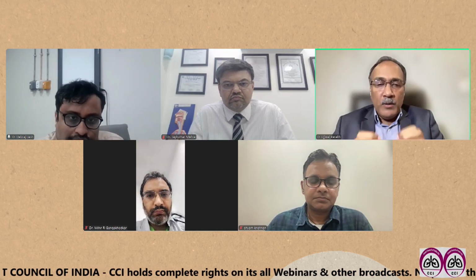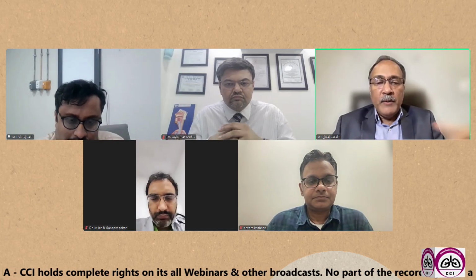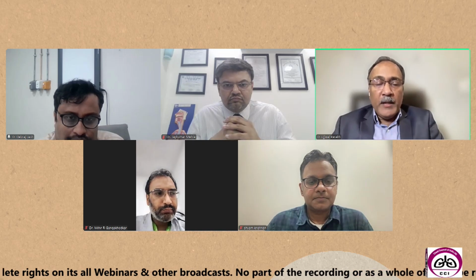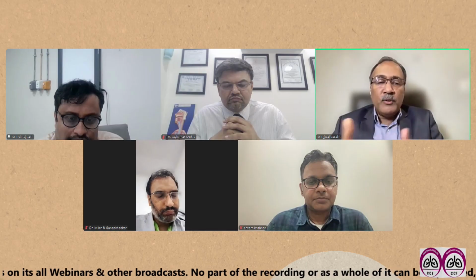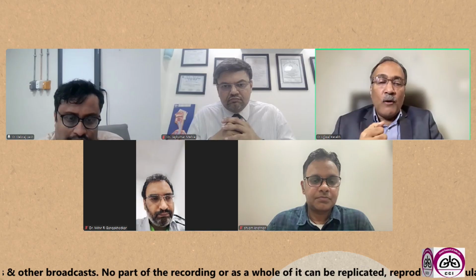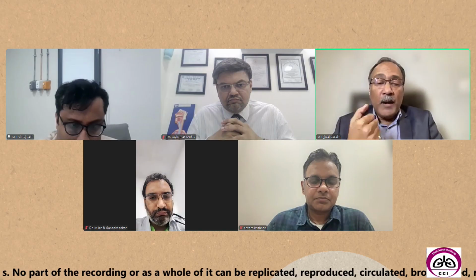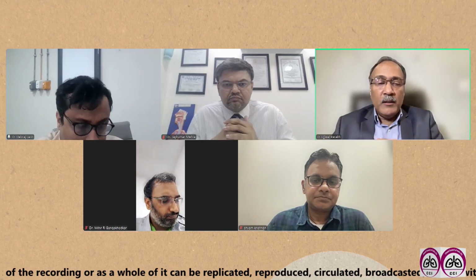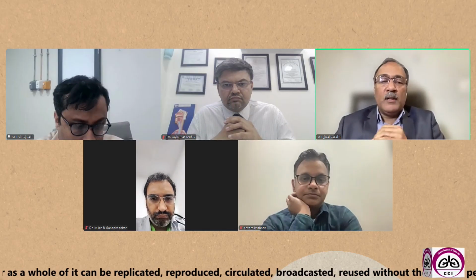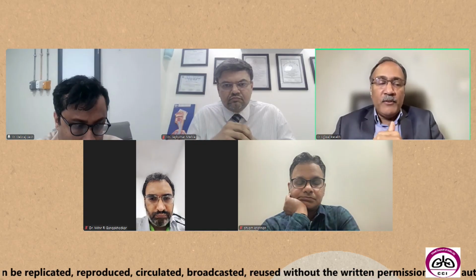So that will help you in focusing more on the procedure rather than on the comfort of the patient. That will be taken care of by the other person. So that is very important, especially when you're beginning. Once you have done a few procedures and you're understanding it very well, you yourself are confident, you can handle minor depth of breathing or minor coughing, then you can start doing it under local anesthesia. But whosoever is starting to do it, do it first under the backup of proper anesthesia and probably an LMA. So that is one thing which I want to say.